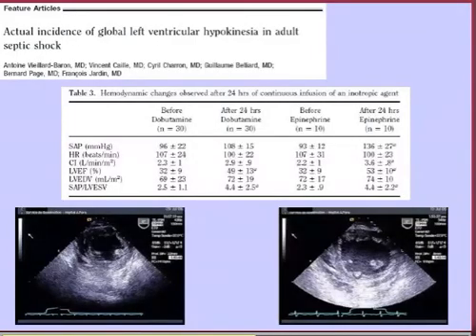And as I said to you, you can check the efficacy of the treatment. And look at this paper we published in Critical Care Medicine in septic shock patients, more than 60 patients, and you can observe the LV ejection fraction before dobutamine, for instance, and after a few hours of infusing dobutamine. And you can check the efficacy of infusing dobutamine. And look at an example here, severely depressed left ventricular contractility, and after a few hours of dobutamine infusion. And of course, this is the same if you want to decide to give epinephrine rather than dobutamine.